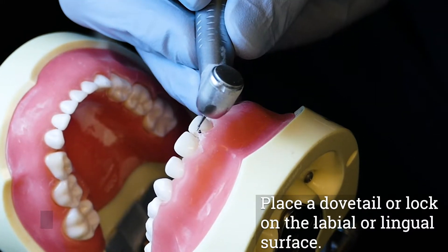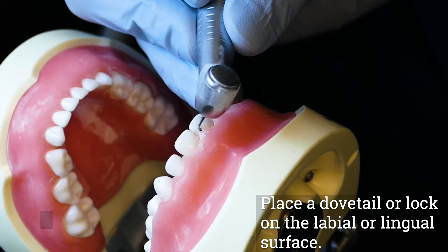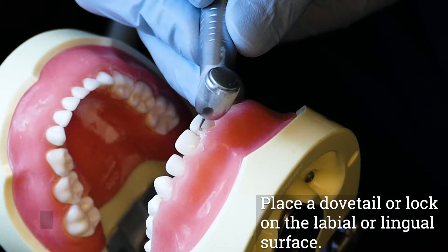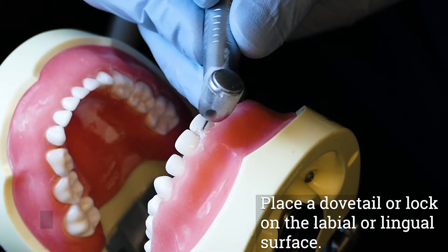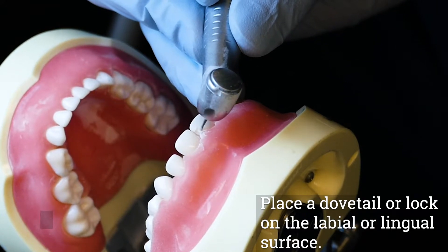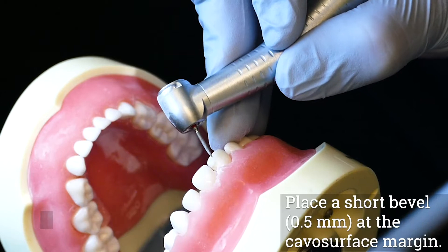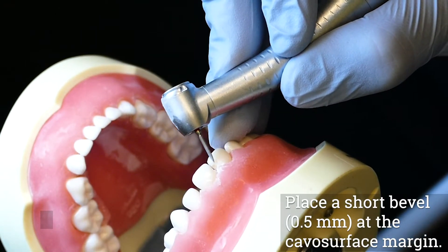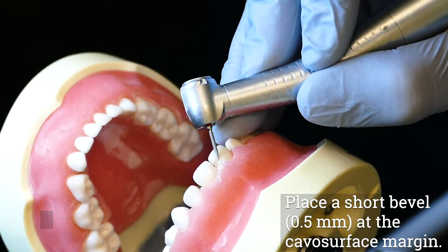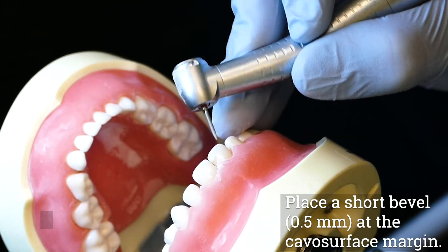To enhance retention, a dovetail or lock can be placed on the facial or lingual surface. However, do not extend greater than halfway across the chosen surface and stay in the middle horizontal one-third, although the preparation may extend cervically if caries extend there. Place a short 0.5 millimeter bevel at the facial surface margin. This may be accomplished with a fine tapered diamond or with a flame-shaped composite finishing burr.